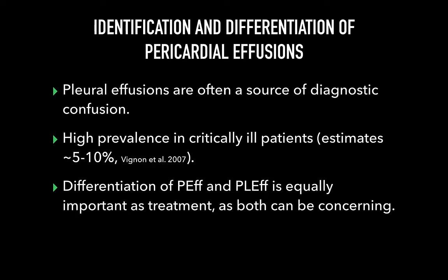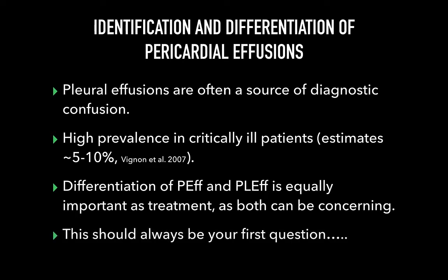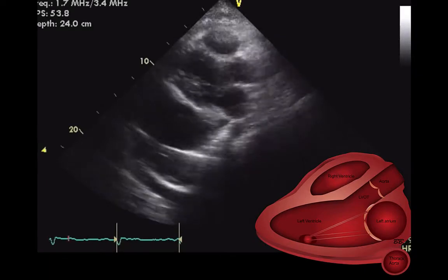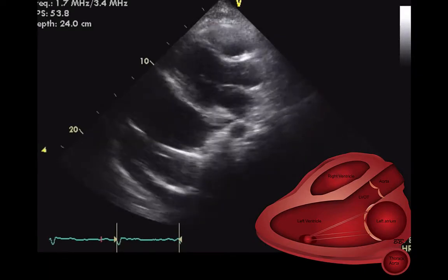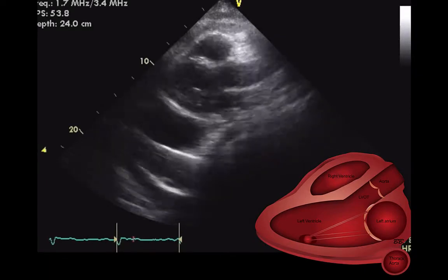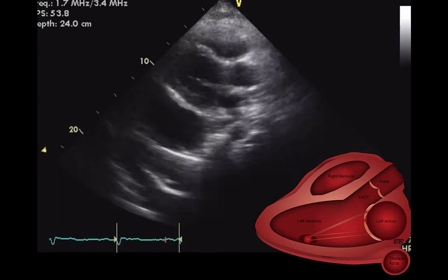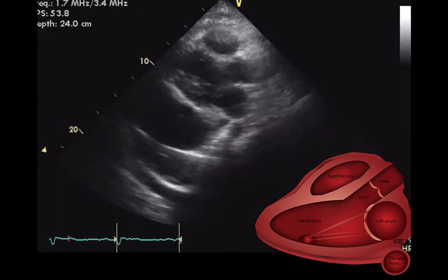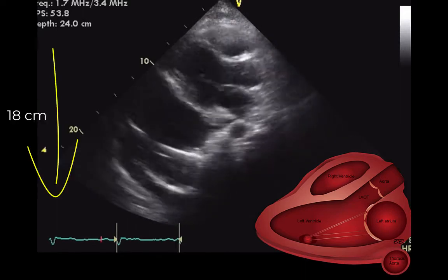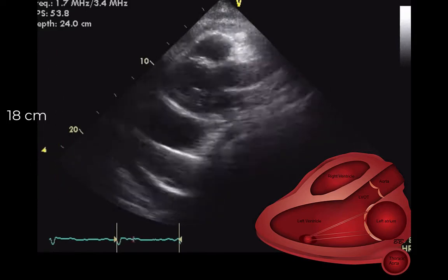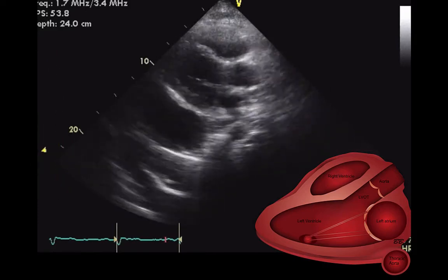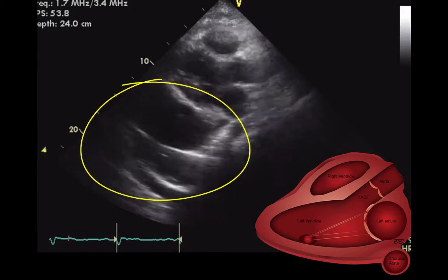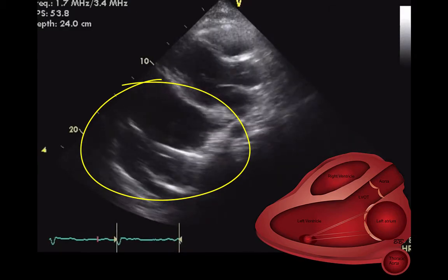Is it pleural or pericardial in nature? Both can be concerning, but the purpose is to find the most dangerous one, which is often pericardial fluid. The first view obtained on any cardiac echo should always be a general assessment view, such as this parasternal long axis view with increased depth, as in this clip. It allows identification of structures just outside the heart that can easily be missed or misinterpreted with a narrow focus.